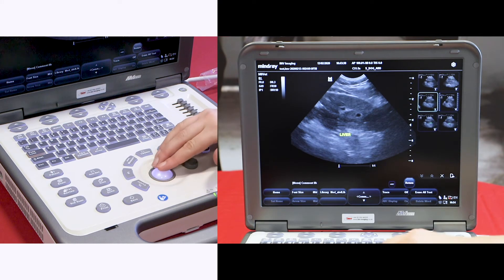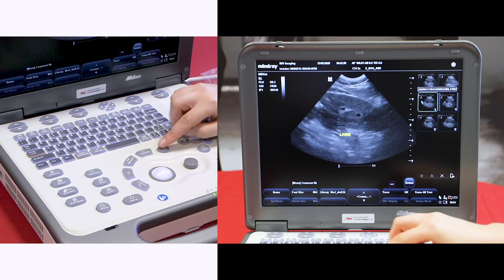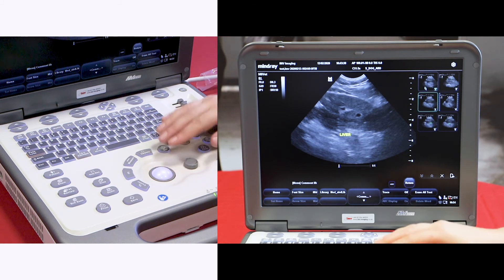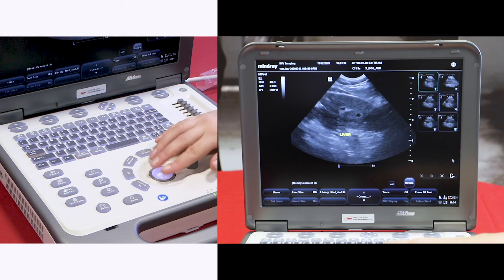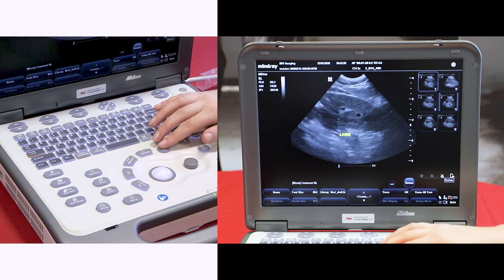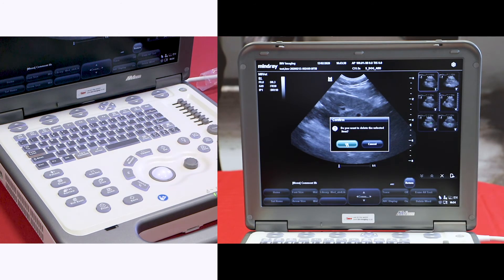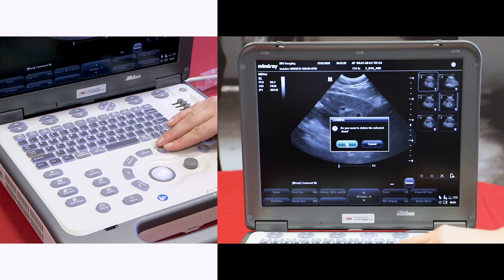If you want to delete an image from here, you can do that. Select the image and go down to the X. The machine will always double-check with you that you definitely want to delete that image.